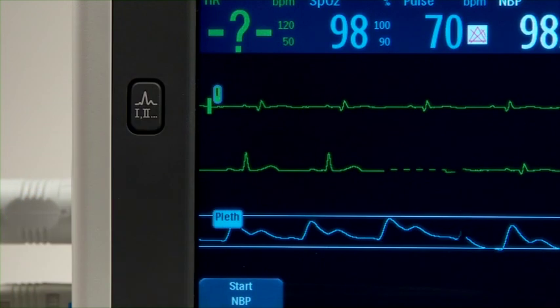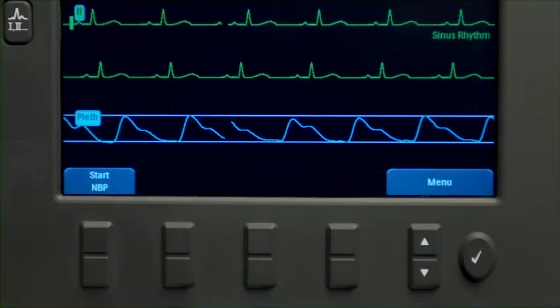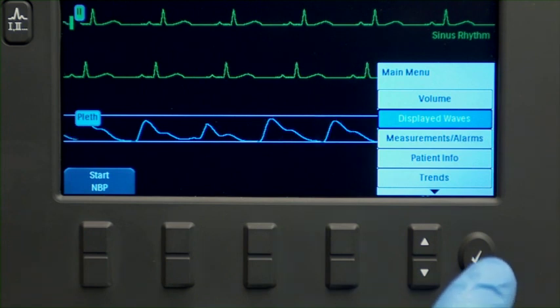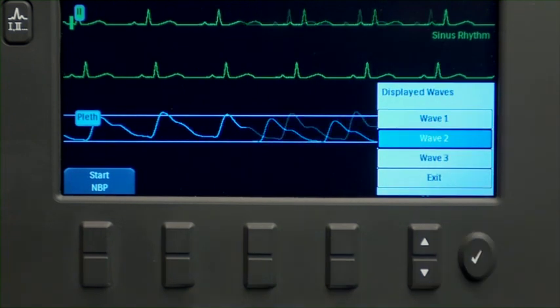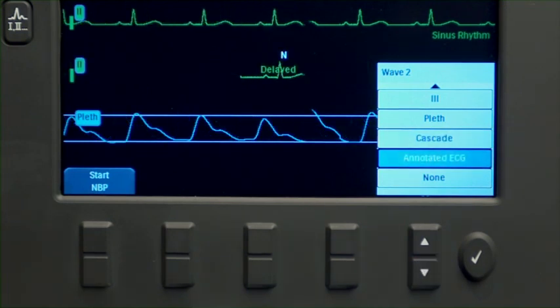Press the Lead Select button to display the desired lead in Wave Sector 1. To change the waveform displayed in Wave Sector 2 or 3, press the Menu Select button, navigate to displayed waves, select the desired wave sector, and select the desired lead.